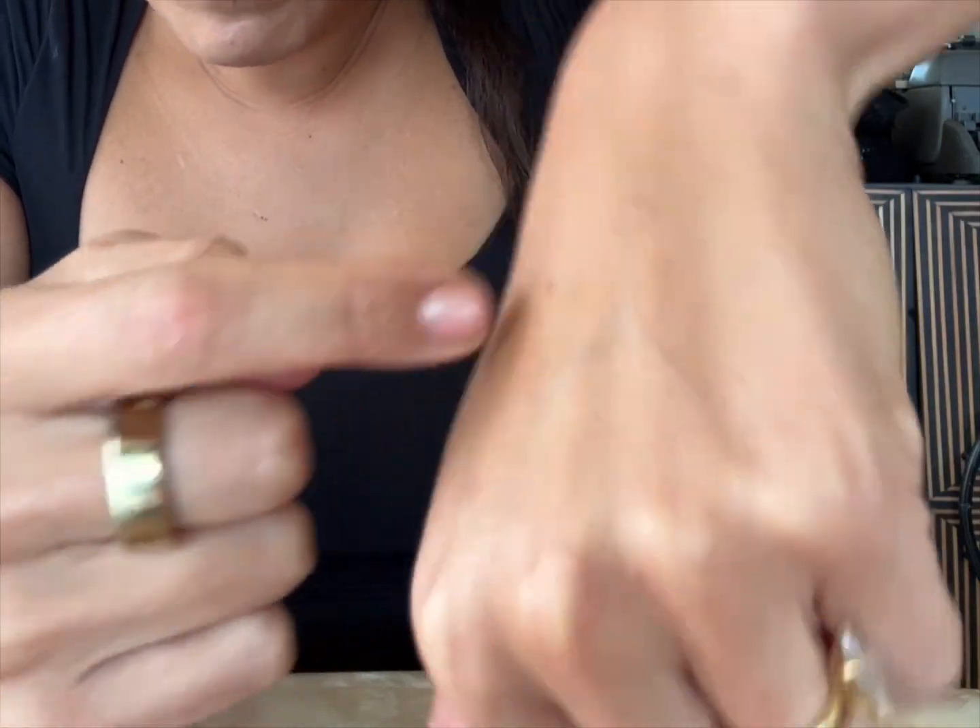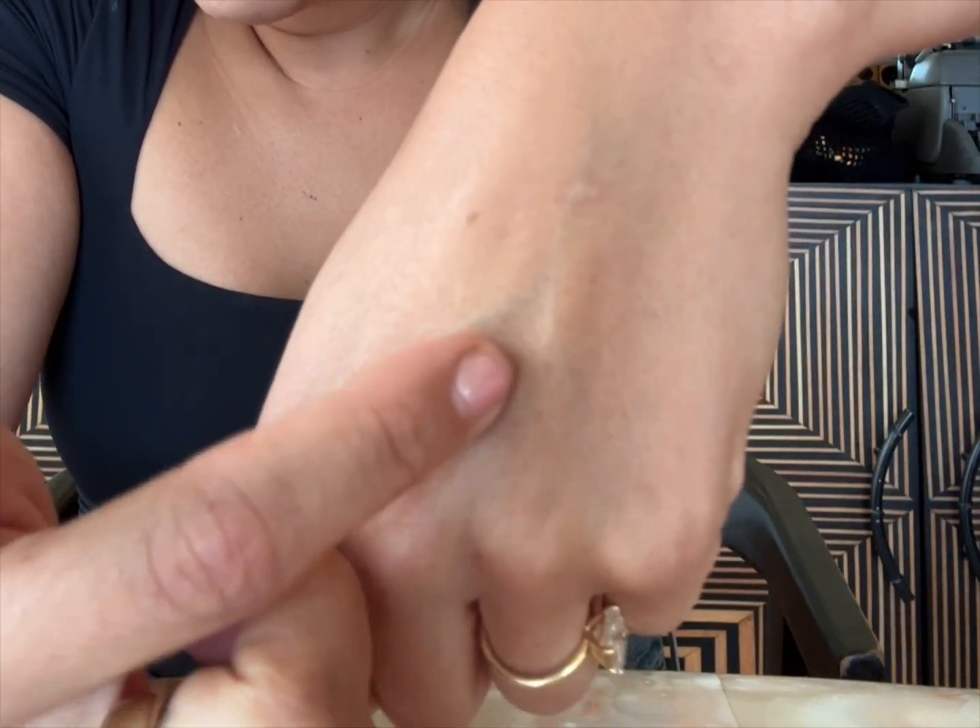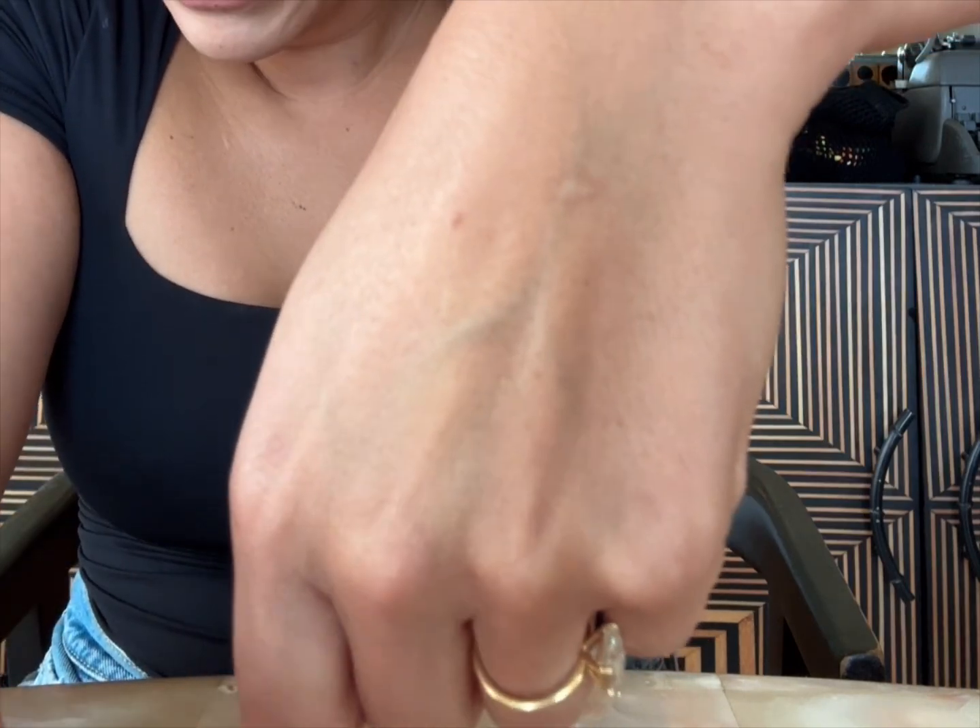You can see this vein in my hand - without any tourniquets it looks small. So I'm likely going to go with a 22, because when I remove the tourniquet my vein is going to go back to this size. If I try to put an 18 in, the vein is going to suction cup to the catheter because it's too big. Yes, you can make veins larger with fluids and warmth, but that takes time, and irritation starts immediately.